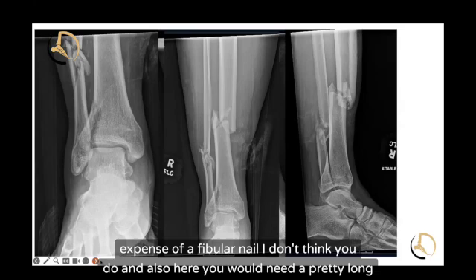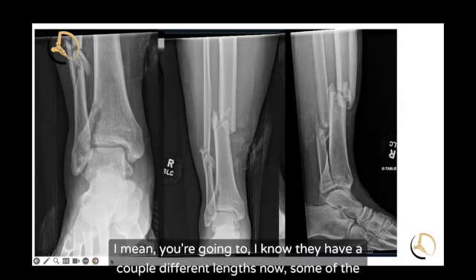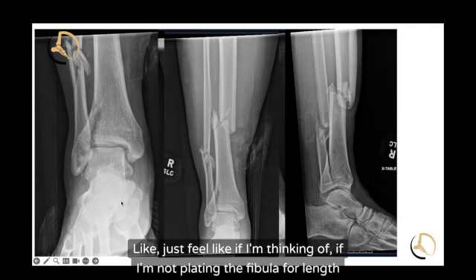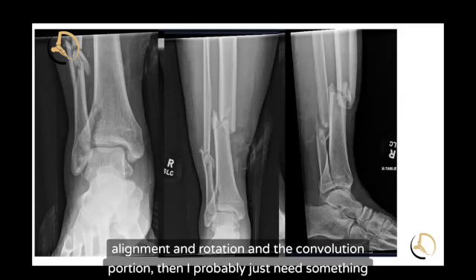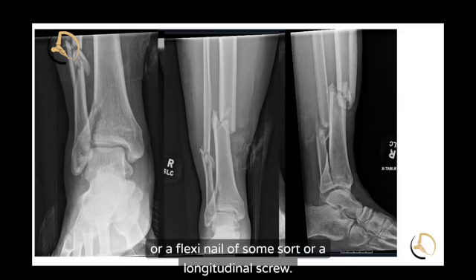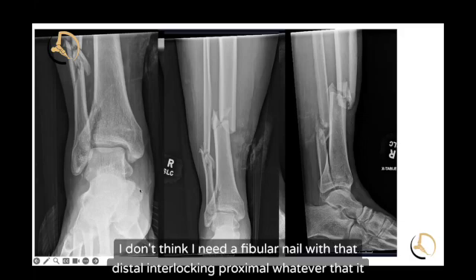You'd also need a pretty long fibular nail here, and I'm not sure it would be long enough. In general, if I'm not plating the fibula for length, alignment, rotation, and comminution, then I probably just need something to strut it out and make sure it doesn't collapse on itself — like a Nancy nail, a flexi nail, or a longitudinal screw. I don't think I need a fibular nail with distal and proximal interlocking.